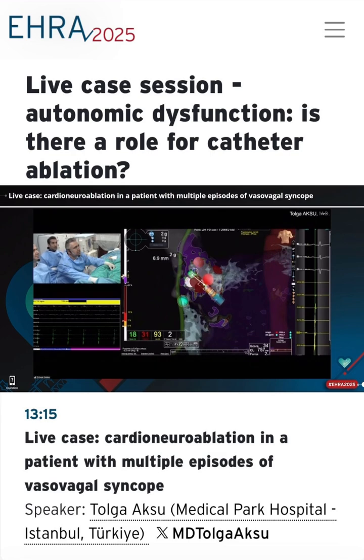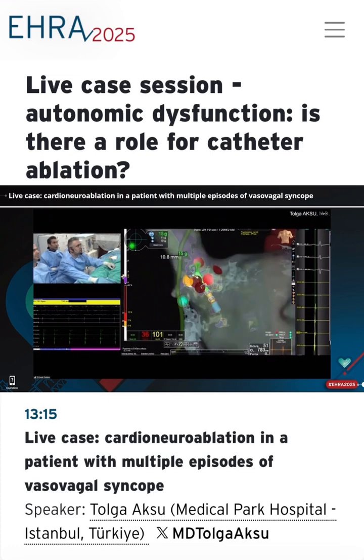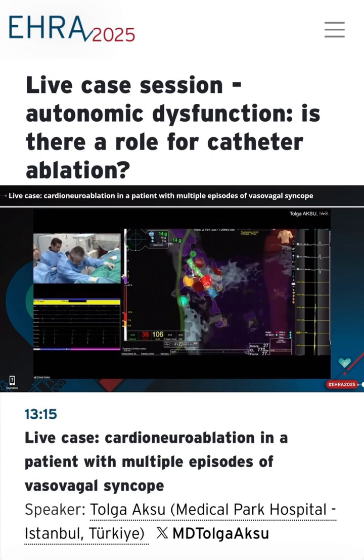There's a question from the audience. Doc, this is Juan Serpa. How are you doing? Nice to see you, my friend. This is a very elegant way to do a cardioneuroablation, including CT image and also electroanatomical mapping. We always disagree on this. I think only one application of radiofrequency won't eliminate the extracardiac vagal stimulation at this point. You're going to need more transmural effect. And this is an endpoint that we're using just to follow these patients, even with long-term follow-up.